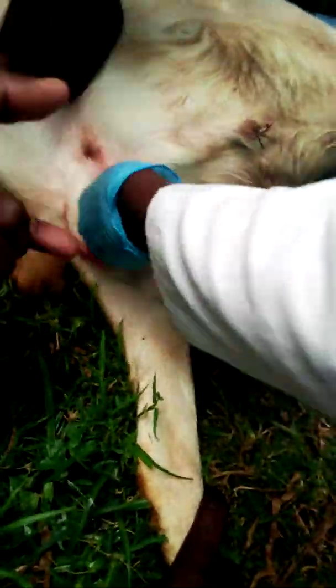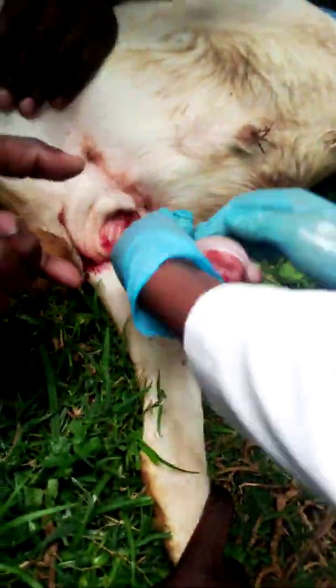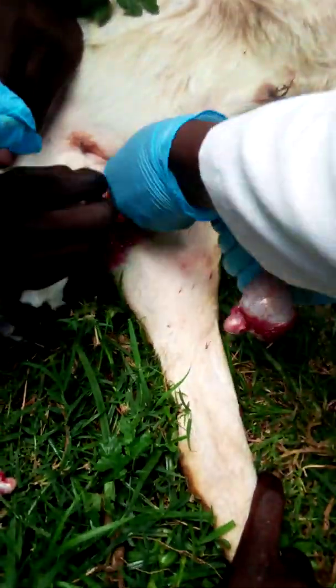You use a blade like this — use the blade to cut it off. No, you just do that to prevent excess bleeding. When you're using the blade, you just do like this. Now you can use the blade, you use it.